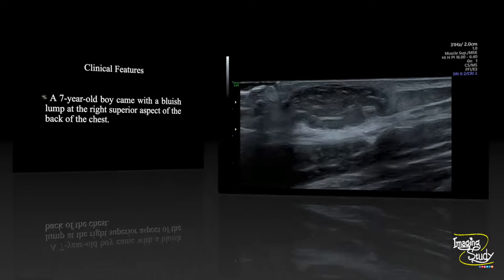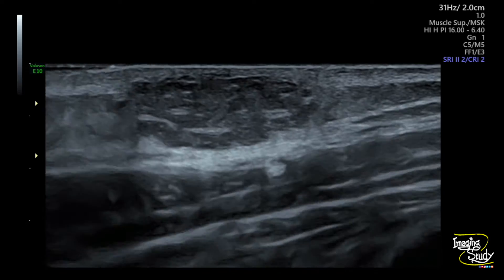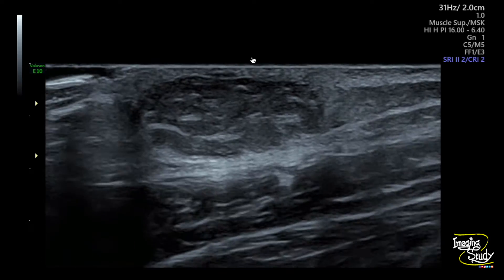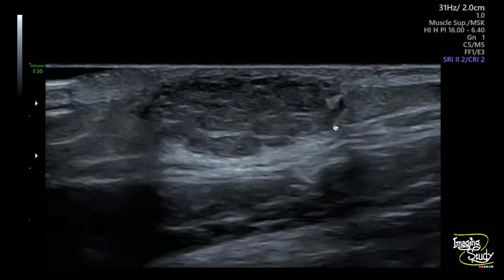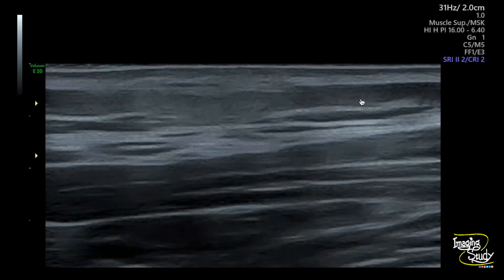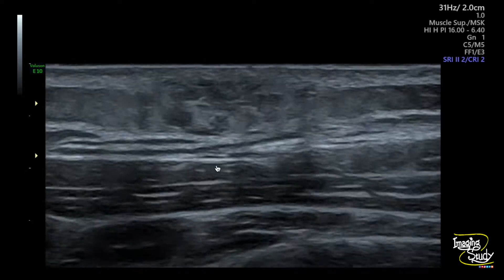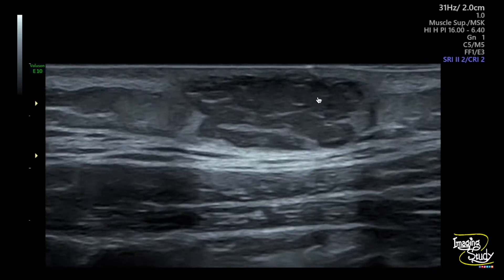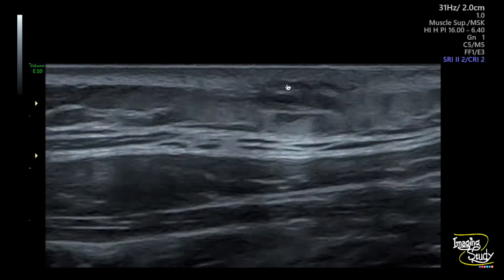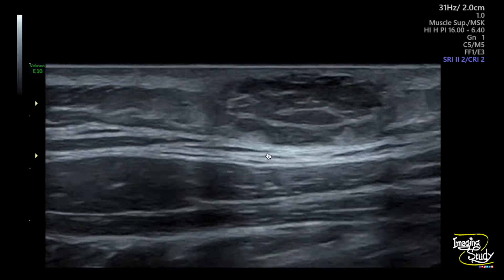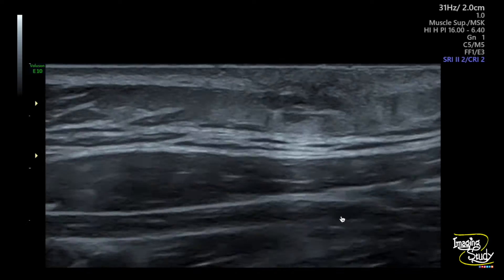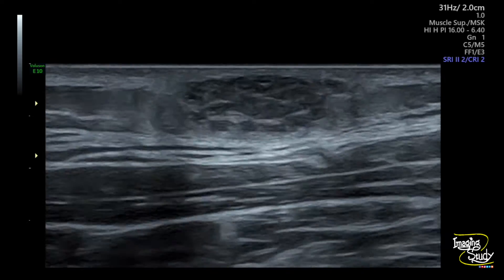Let's see what we have on ultrasound. Here you can see the long section of the lesion — an oval lobulated structure at the subcutaneous layer. The lesion is hypoechoic, quite well defined, and there is no intramuscular or intrathoracic extension.